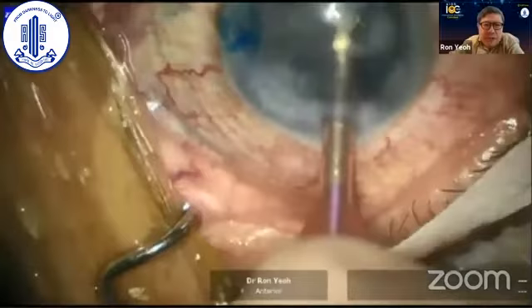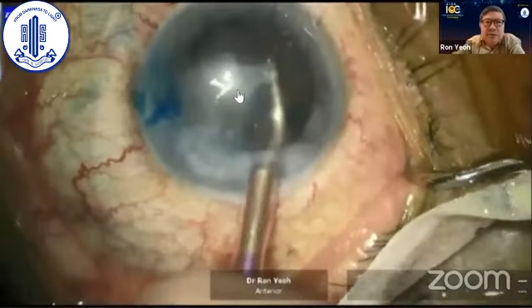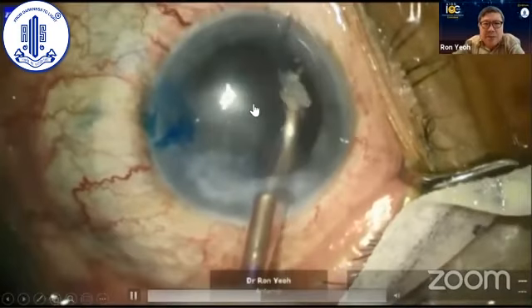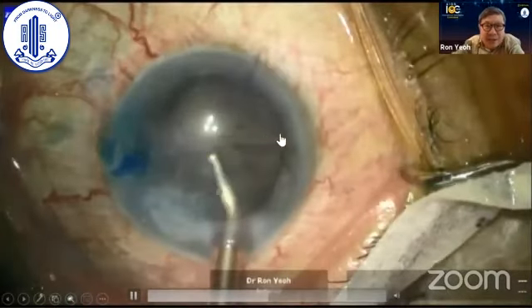And at the end, I'm just doing my IA of the last bit of cataract. The view isn't great because this quadrant of the cornea is hazy from the cornea melt. And then I see that line there. Do you see that line distally there?